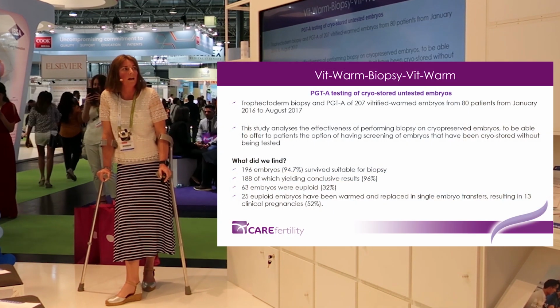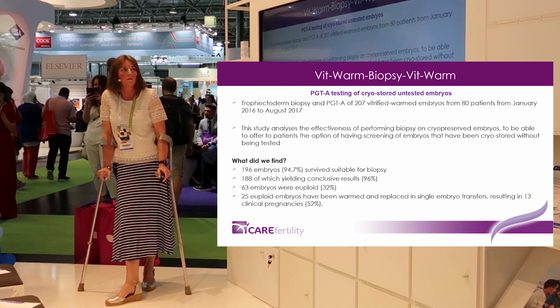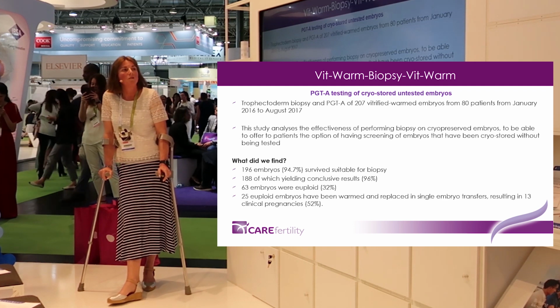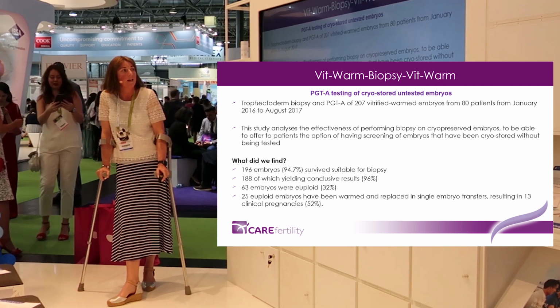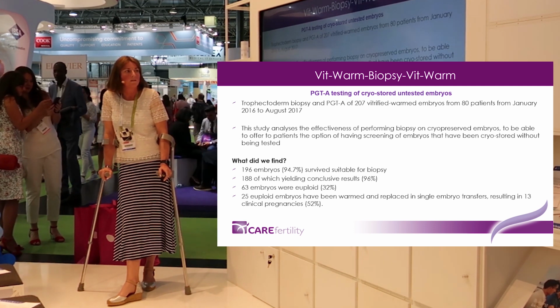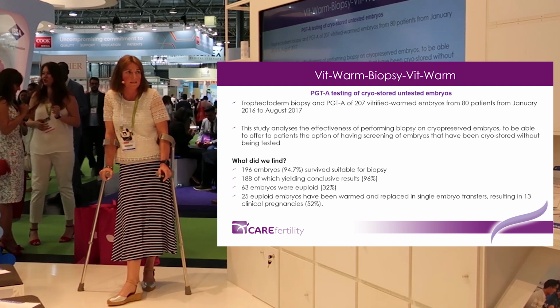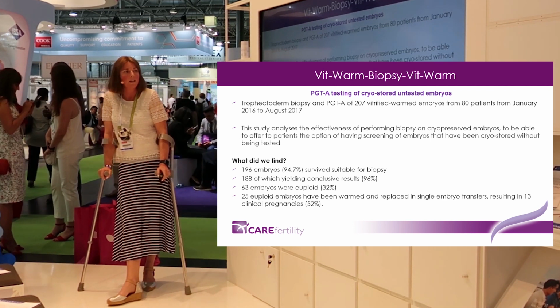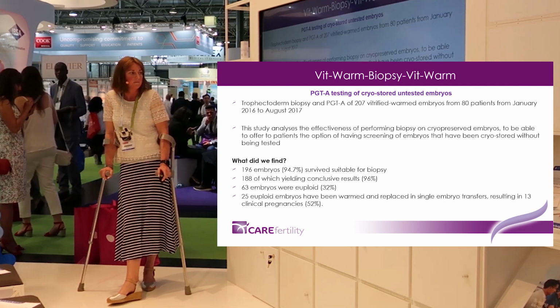We've also looked at the vitrified stored untested embryos and warming them, 80 patients over 18 months to 2017, to have a look at the effectiveness of performing a biopsy on these embryos, to offer patients the chance to screen the embryos that have been cryopreserved without being tested.